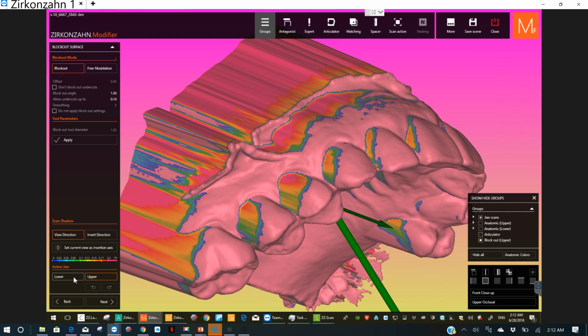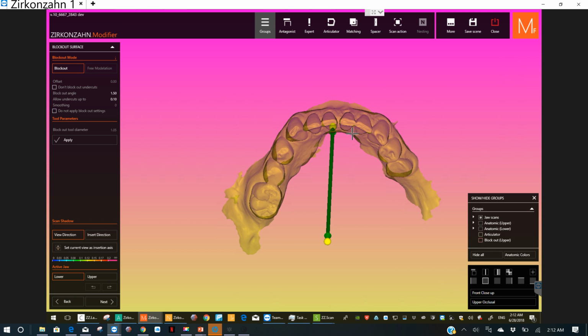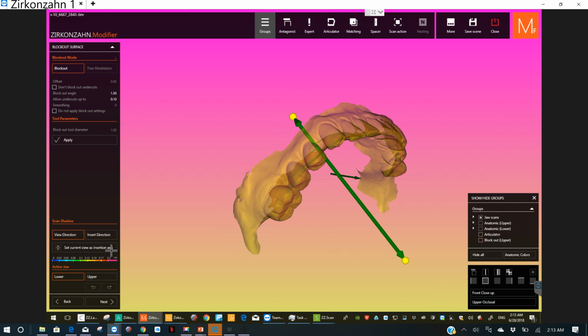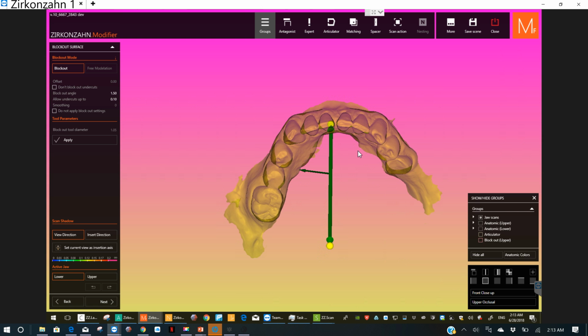And now let's go do the same for the lower. This is exactly what we do when we make a removable orthotic. So same rules apply. You want to see that lower outside edge of the teeth. And let's set to the view, and it's kind of hard to see, but there's a little arrow right there. When you hit view, it points at your eyes. So make sure that the thing is the way that you want it to go in when you do it.